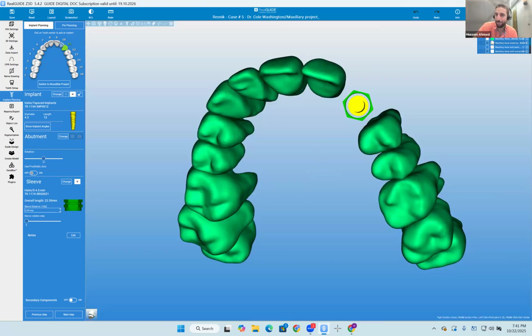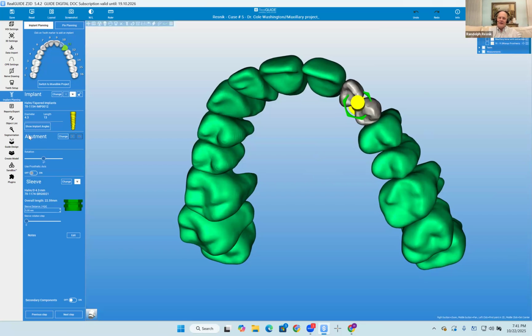So Cole, remember how we treat lower anterior implants? We put one implant in the embrasure for 2 teeth. You're going to do the same here. That's what I was going to ask. I didn't know if it would work at the top. Yeah. It would still look good. This is rather uncommon. No, it'll look perfect because you're going to be lingual. So it'll be coming through the lingual. This will be perfect. However, you're going to have to do a bone graft.